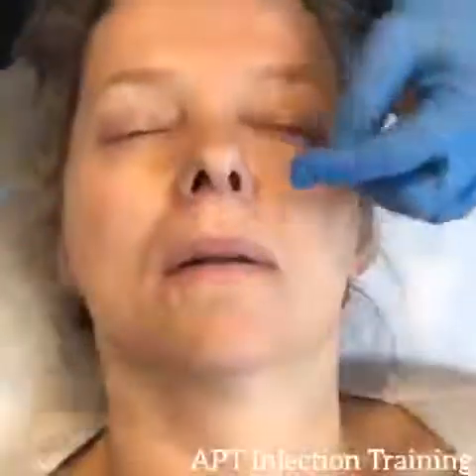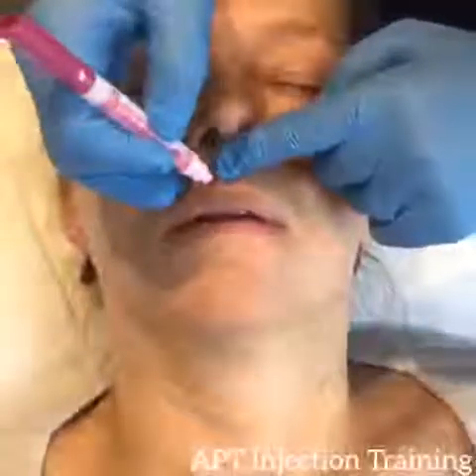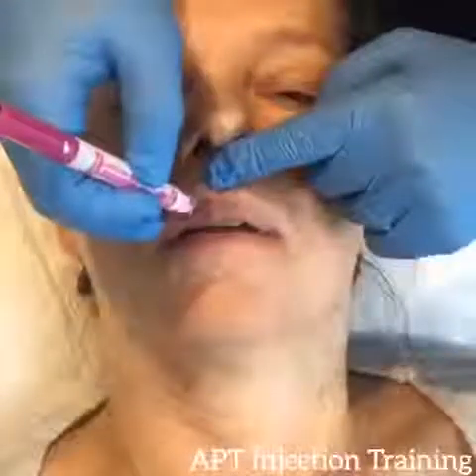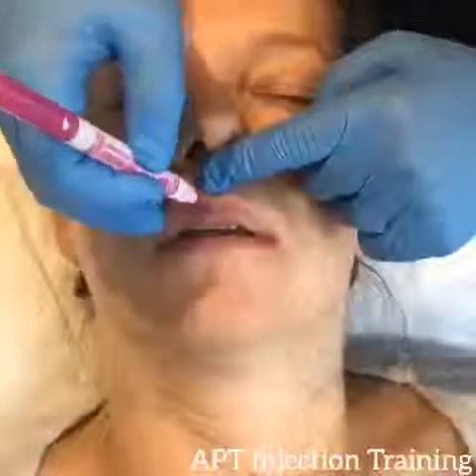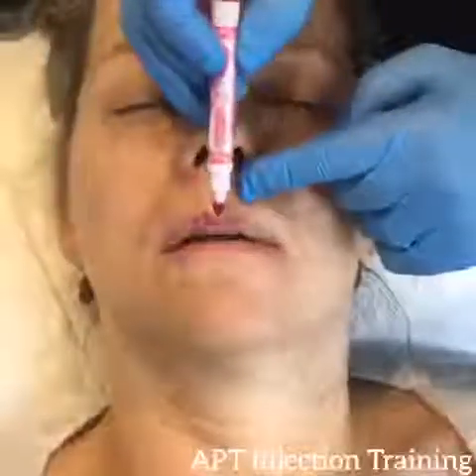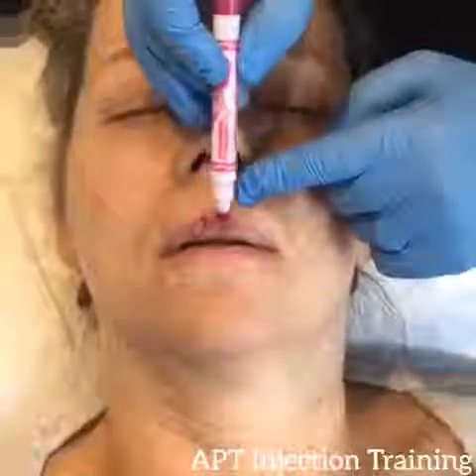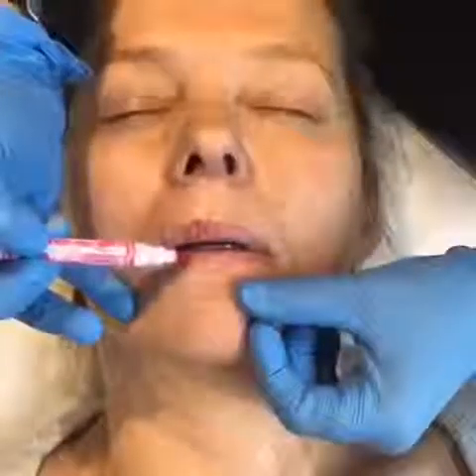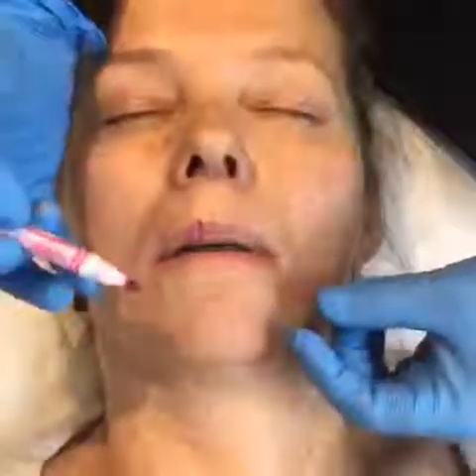So when I'm injecting a lip and I'm using needles, I actually do an inverted fan technique. I come in and start at the top of the Cupid's bow, and I do one injection as a central stalk, one laterally and one medially. The fullness on the lip should be on the upper lip, central and on either side of midline. That's where the tubercle should be. And on the lower lip, the tubercle should be on either side of midline. Again, you can think, if someone has lip gloss on, it's where the light should reflect off the lip.